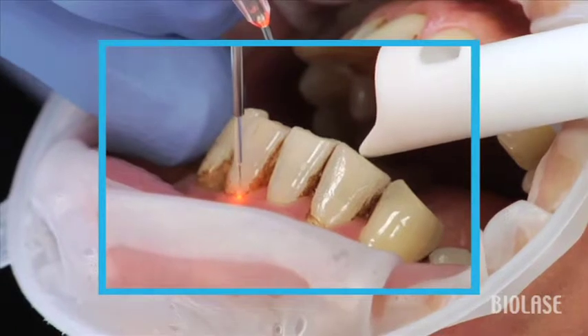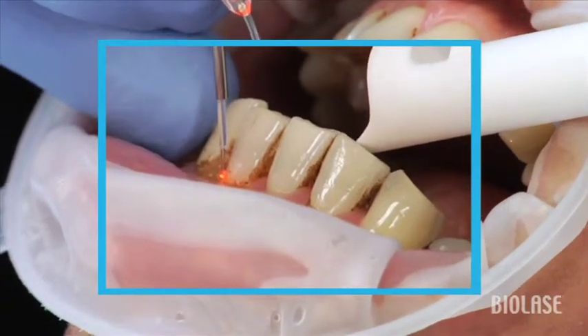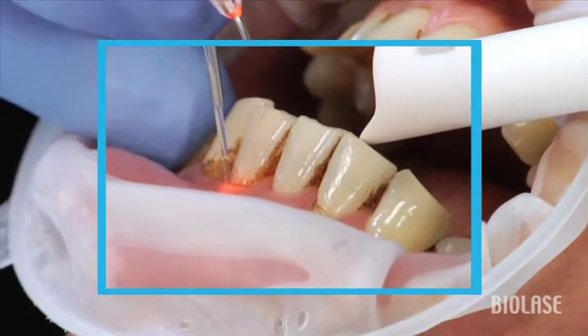So if you use a side-to-side motion rather than a J-shaped stroke, it won't provide maximum efficacy for the procedure to be performed.